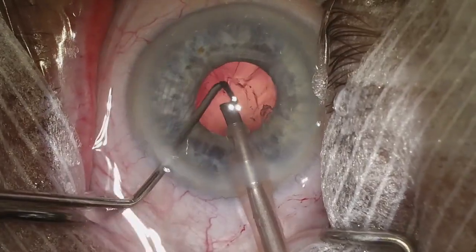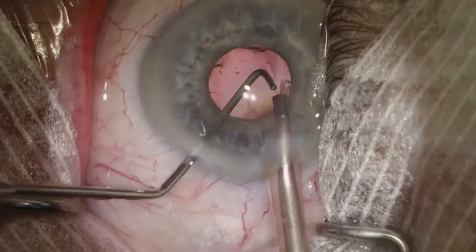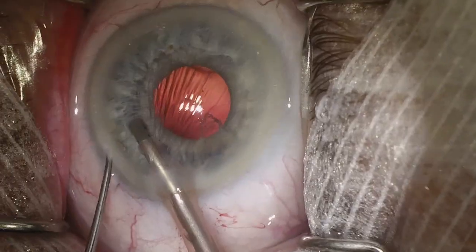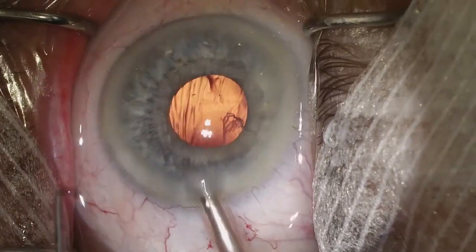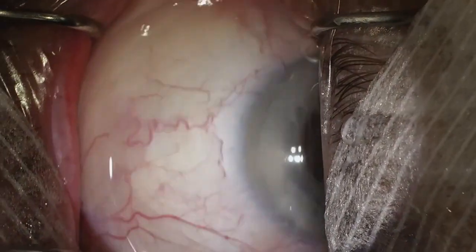We can see we did a good hydrodissection — there's very little cortex. We did a good cortical cleaving hydrodissection, which is also nice in these cases so you don't have to worry as much about IA. We're just going to remove some nuclear fragments that may be present, and then I'll take a capsule polisher and polish the posterior capsule.